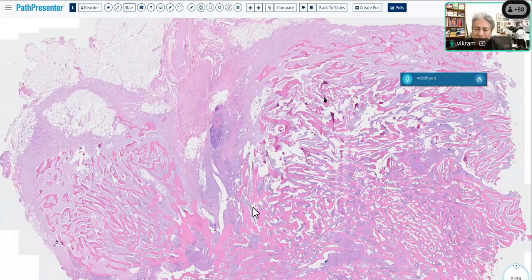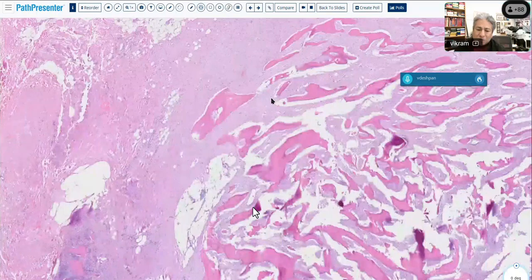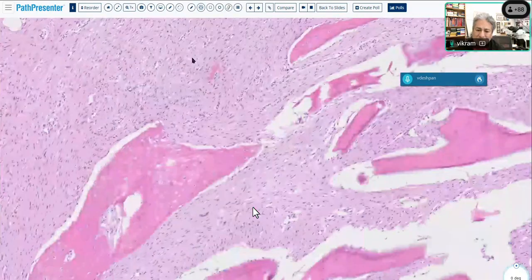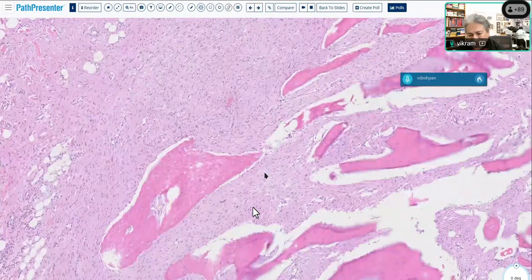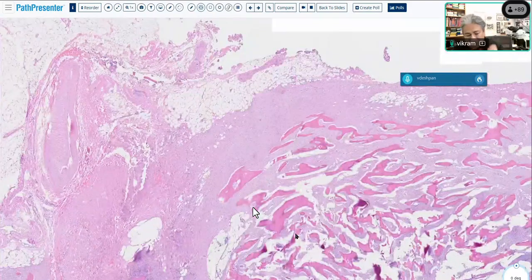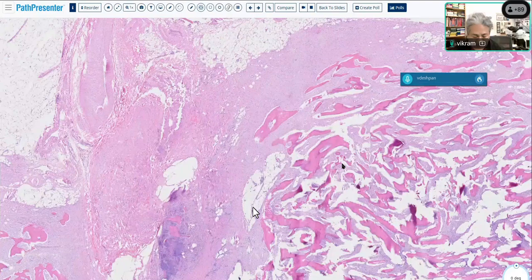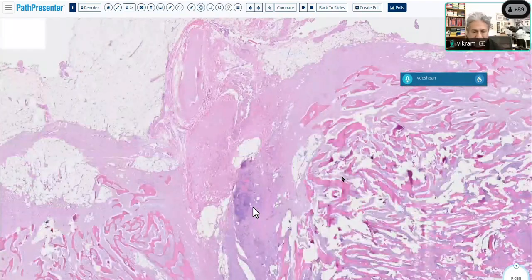What we got on a biopsy was a very small area like this, and we weren't sure it was malignant, just a little bit of bone and a little bit of fibrous tissue. Because we could demonstrate MDM2, we called it a parosteal osteosarcoma, of course with the radiologist. Carrie Henselman, my surgeon, told me, I think this is a parosteal osteosarcoma. And the radiologist told me that it's a parosteal osteosarcoma, and now I'm happy.